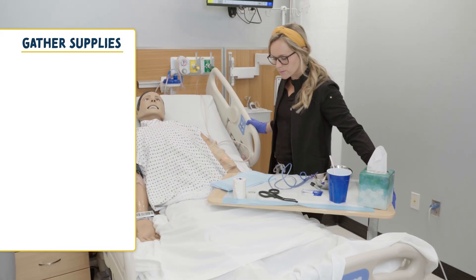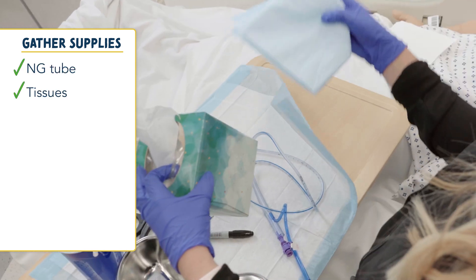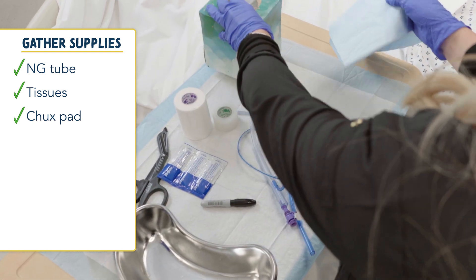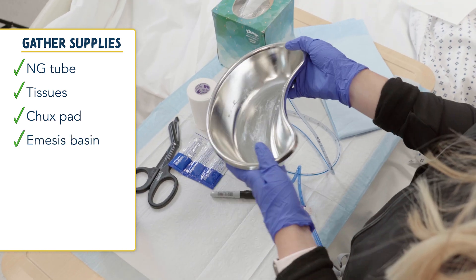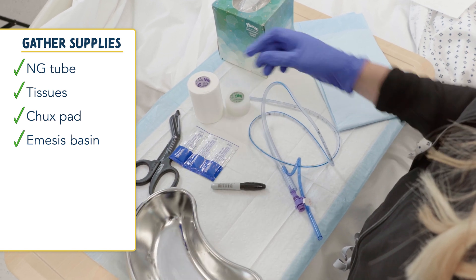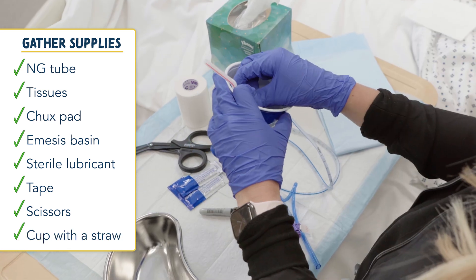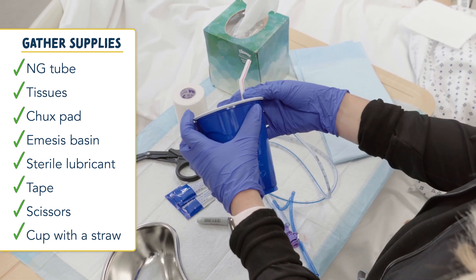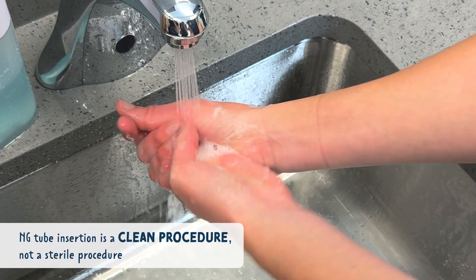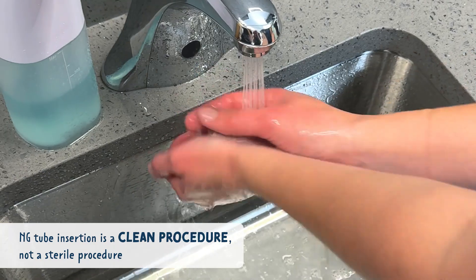Let's gather our supplies. We will need our NG tube, a tissue and a chux pad for the patient's chest in case things get messy, and an emesis basin — patients can vomit during administration. We'll also need sterile lubricant, tape and scissors, as well as a cup with a straw. Now we can perform hand hygiene. It's important to remember that NG tube insertion is a clean procedure, not a sterile procedure.